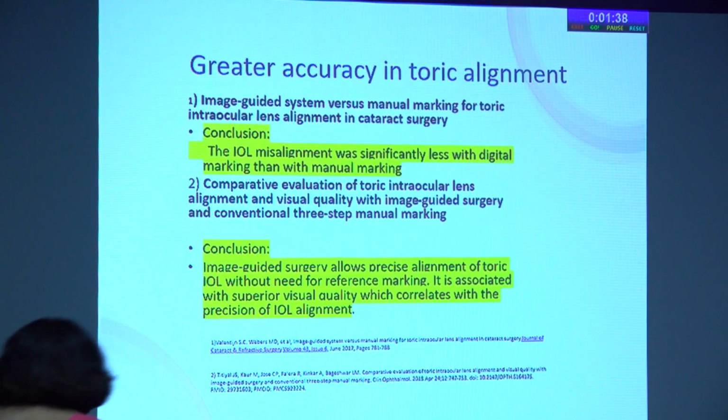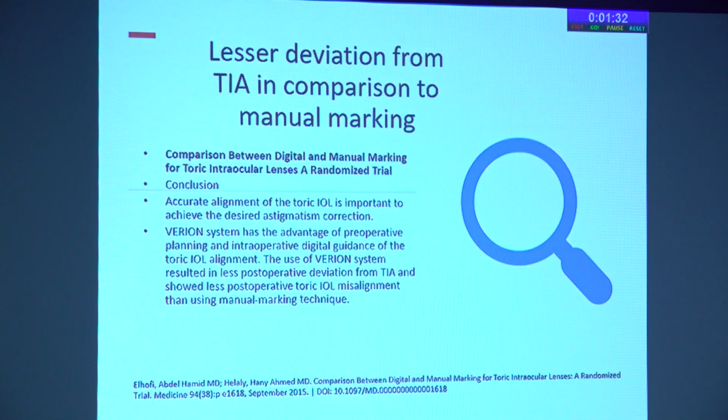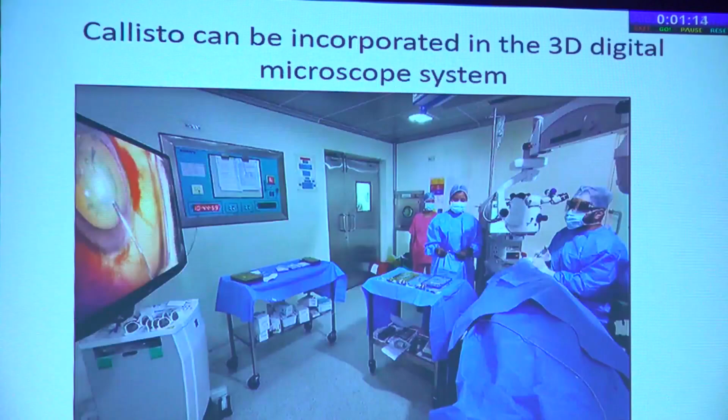So again, these are four very well-reputed studies from well-reputed journals telling us that intraoperative imaging does give us a significant advantage. Another thing is it also has less deviation in the target-induced astigmatism when compared to manual marking. This was done with the Alcon system as well. Like I said, there is no real difference in the outcomes when you use the Alcon or the Zeiss system, all of which are very predictable and give you good results.